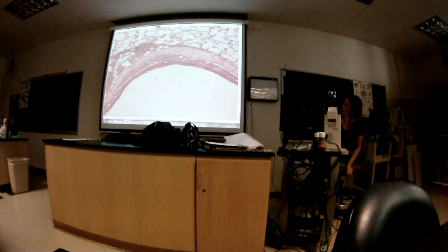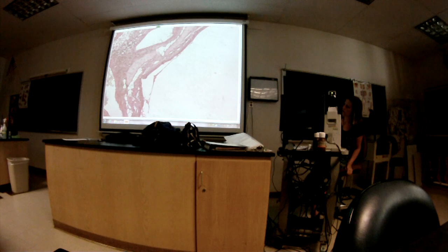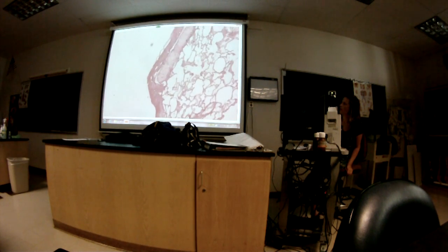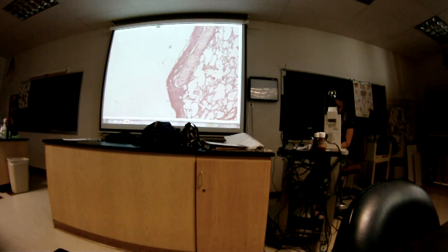So we're looking at, of course, this here, so I'll move around so you can see. So what is that organ, question 10?